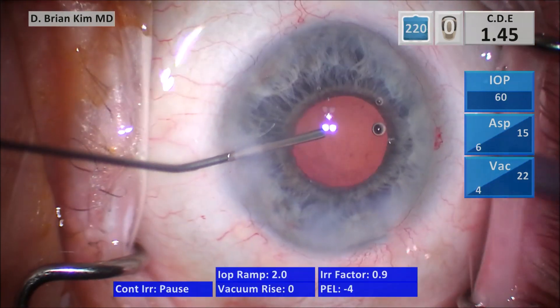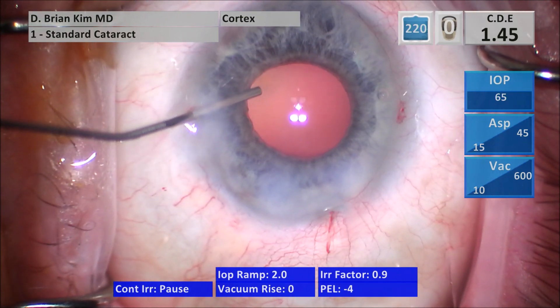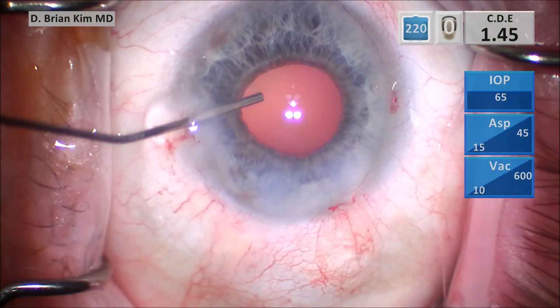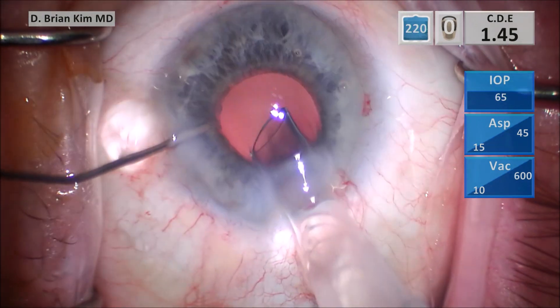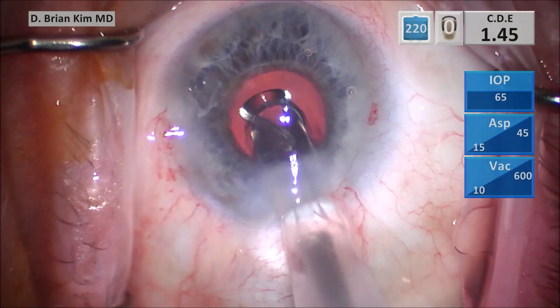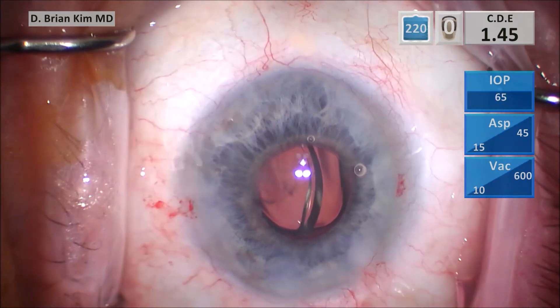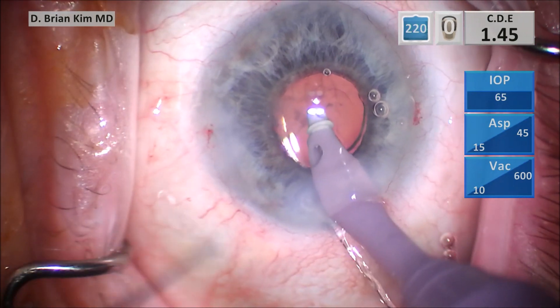I'm injecting some cohesive viscoelastic to inflate the capsular bag and anterior chamber. This patient actually has a high-powered lens, and as a result I'm going to widen the incision a little bit. I'm injecting the single-piece acrylic intraocular lens into the capsular bag, making sure that I'm tilting the leading edge so that it goes into the capsular bag. I quickly go in, inflate the eye, and tap the lens, making sure it's in the bag, then use the Maltzman to ensure that both haptics are in the bag.